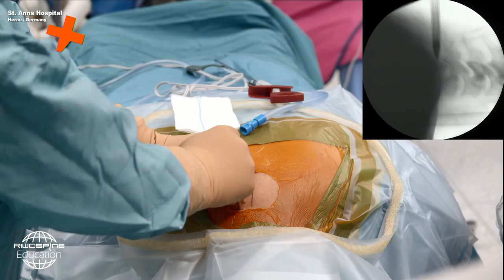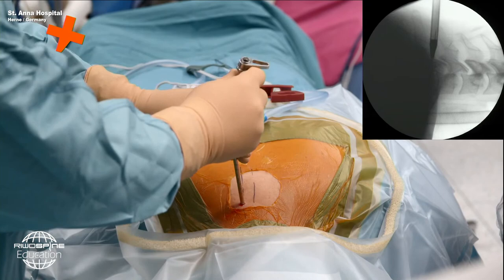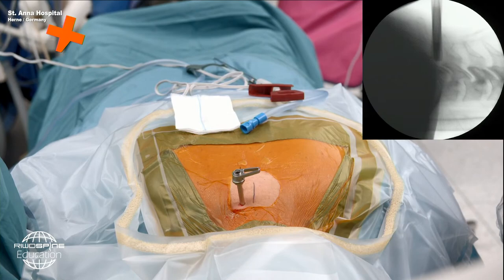Okay. And then we insert the beveled operation cannula, opening to the medial aspect. It's very similar to what we do at the lumbar spine. So now the cannula is in front of the lateral mass, and then we insert the endoscope and start to work.